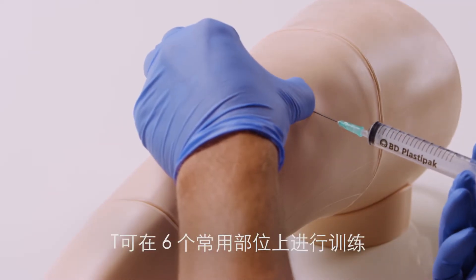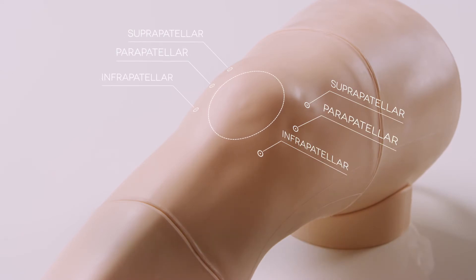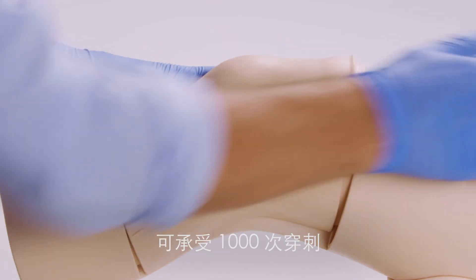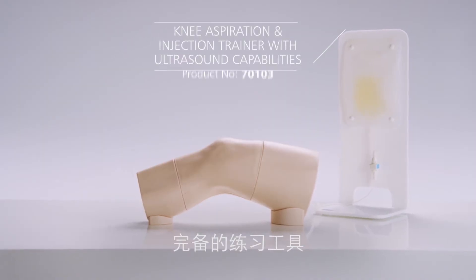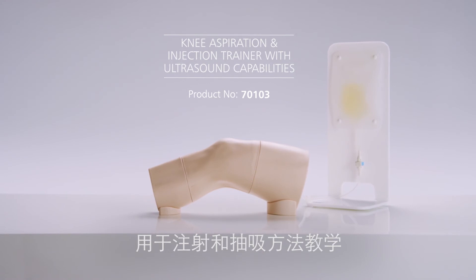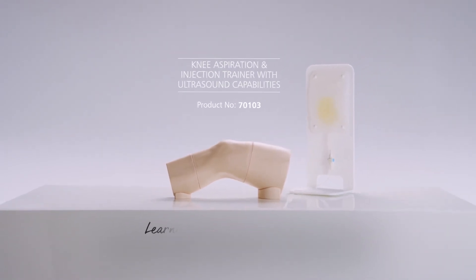Aspiration and joint injections can be practiced across the six most commonly used sites on the knee. The cost-effective module can withstand 1,000 stabs before replacement. The trainer offers a complete training tool for aspiration and joint injection, allowing the practice of fundamental skills in a safe environment.